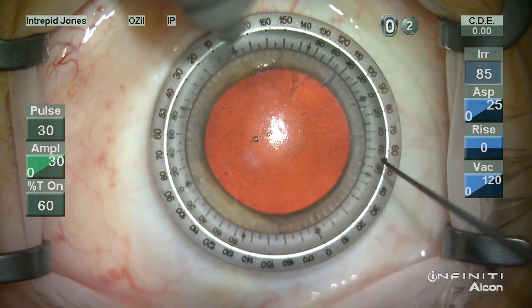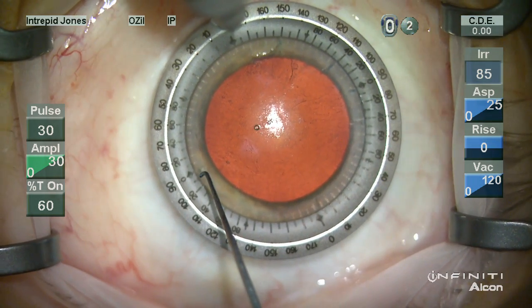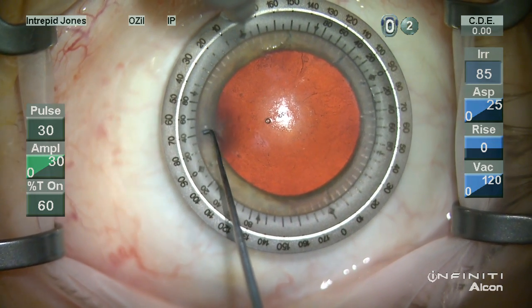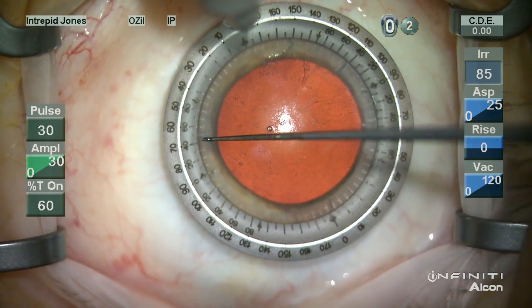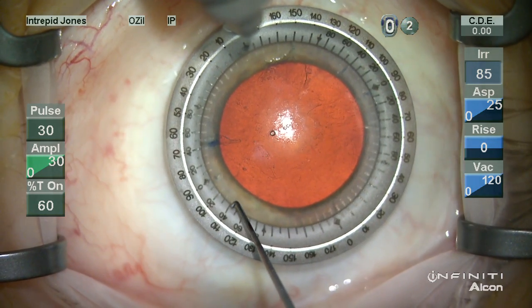You can see that the inner bevel has an easy readout for arcuate length on either side of the zero degree mark, although I do like to step out these values to ensure that I have a proper arcuate length.